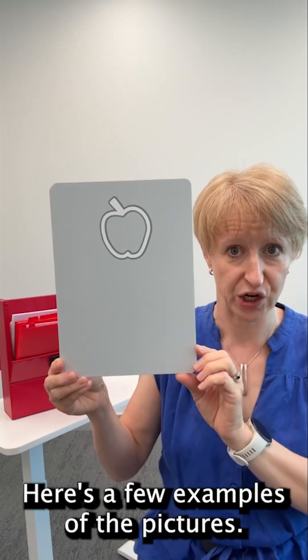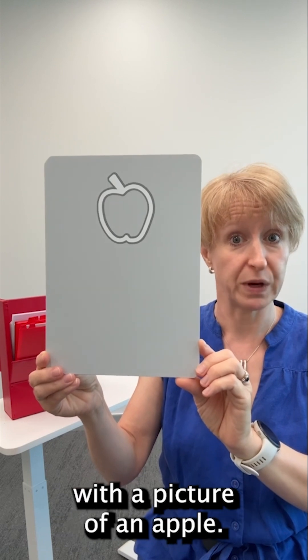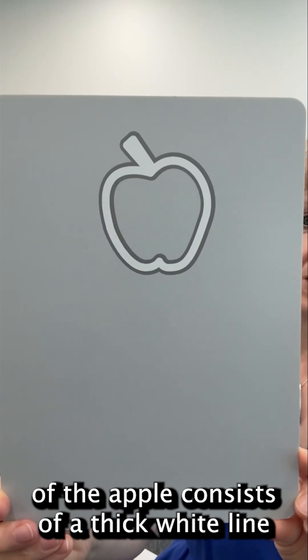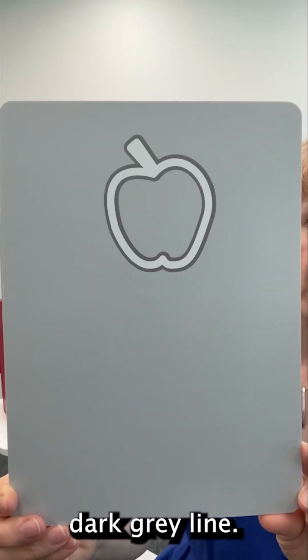Here are a few examples of the pictures. The card I'm holding up is a grey rectangle of card with a picture of an apple. If we look carefully at that design, you can see that the outline of the apple consists of a thick white line surrounded on both sides by a thinner dark grey line.